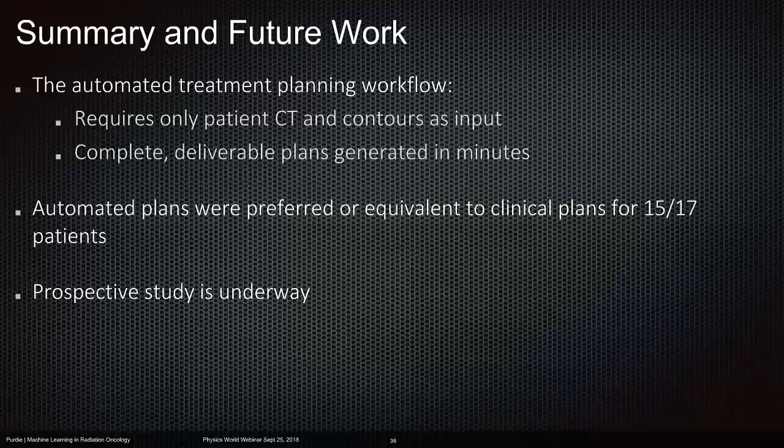When we did our technical study on oropharynx, that went much faster, only because the actual volume that's irradiated is much smaller than, say, in something like prostate. So we could actually plan oropharynx, although deemed much more complicated, faster. That's really interesting and provocative in that what we deem right now as being complicated to a machine does not, right? It just sees it all being the same. So prostate will probably be less than 10 minutes, and this will just keep getting better.